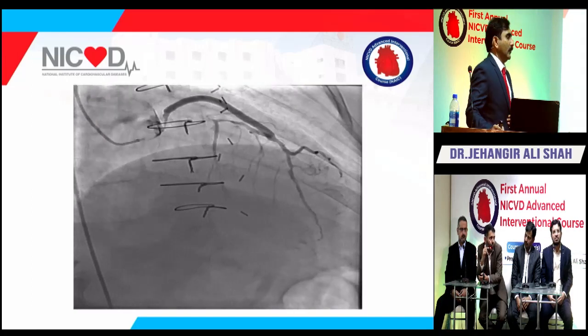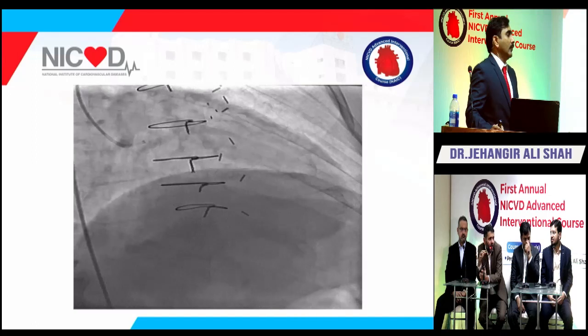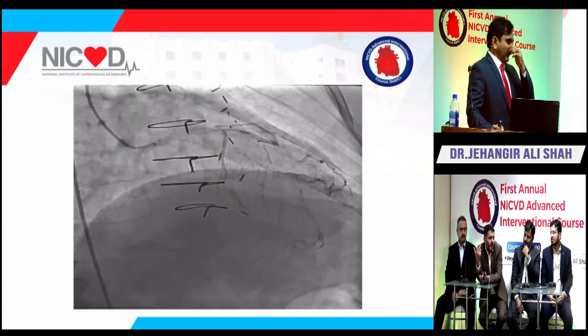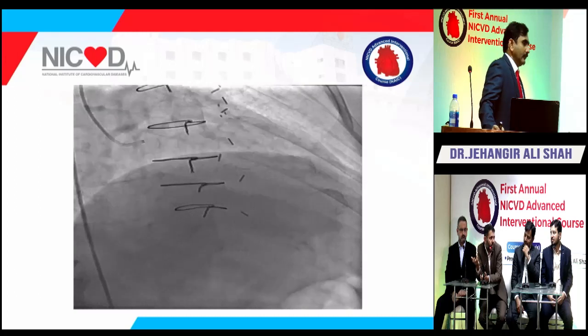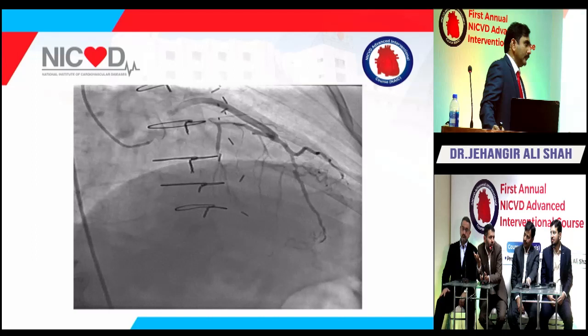So in this scenario you can't go for CTO. You should do the PCI of this vessel with all safety measures, just like embolic protection device and IABP, as already mentioned. So you can directly go for PCI to SVG to LAD in this patient.